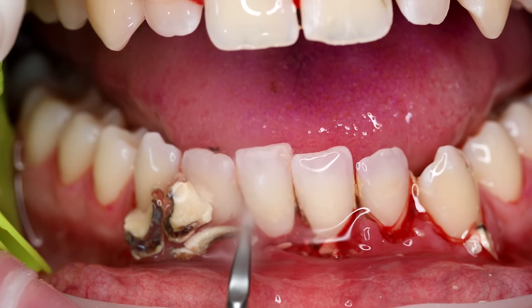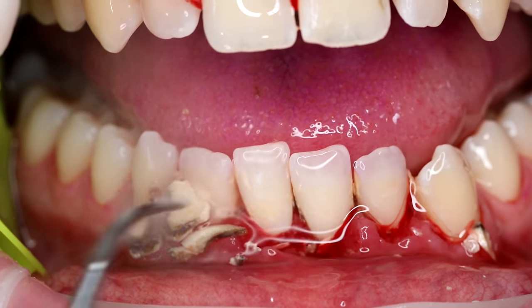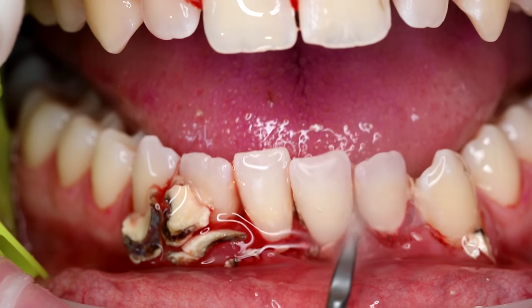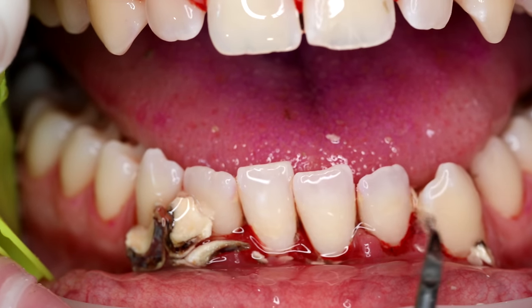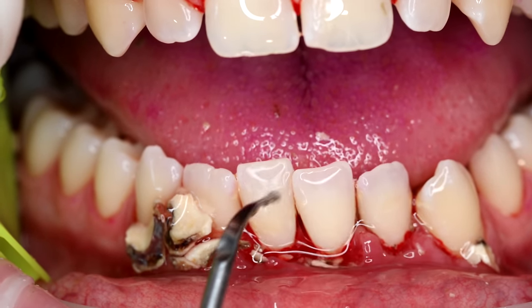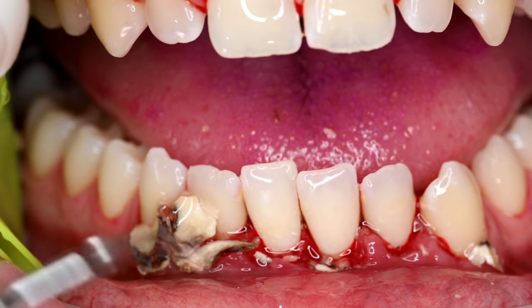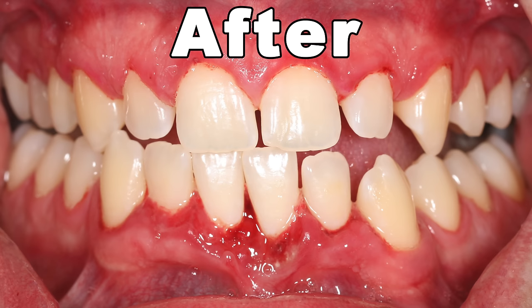Super cool is we were able to clean everything without having to pick up a single scratchy scaler. This patient just had their teeth cleaned comfortably and now has a completely fresh start. His instructions at home are to water pick once a day, brush twice a day, and use a mouth rinse, and then he should be looking amazing over the course of the next 6 weeks. So let's compare the before and after. Let me know what you guys think in the comments.